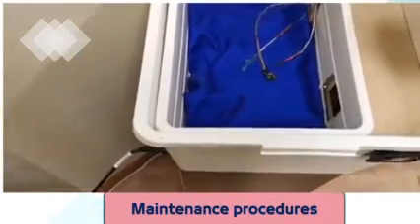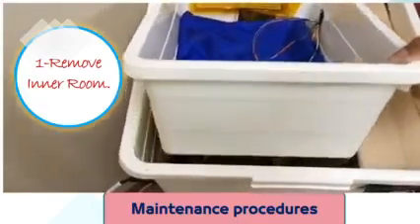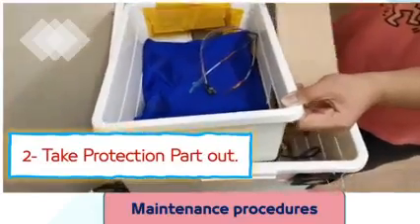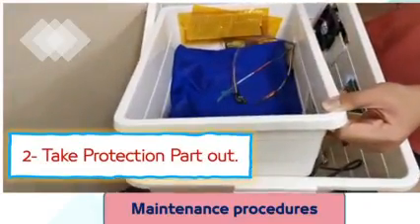Our maintenance procedure: first we need to remove the inner room. In order to remove it, we're just going to lift it up a little bit. So after we lift the room, we take this protection part out. Then we can see our humidifier and our wires.